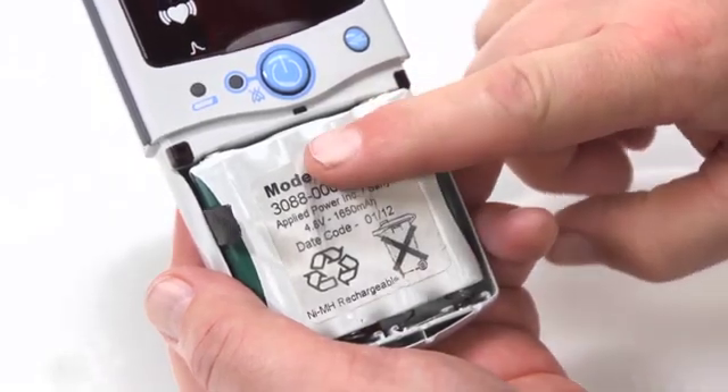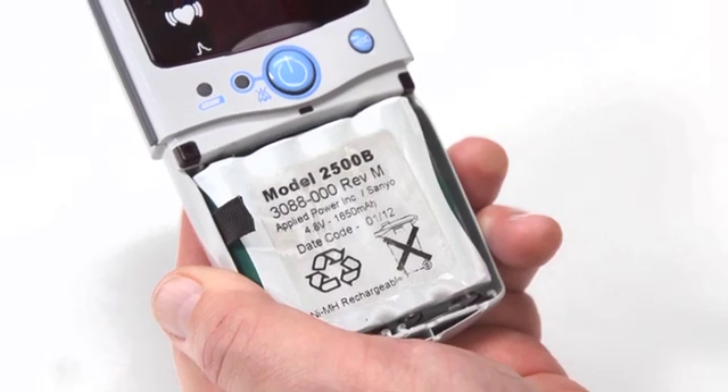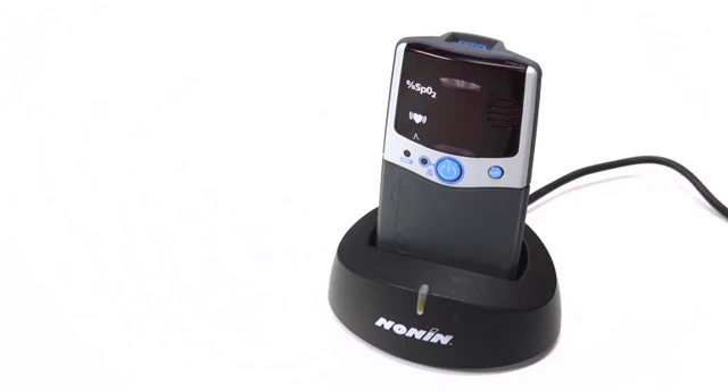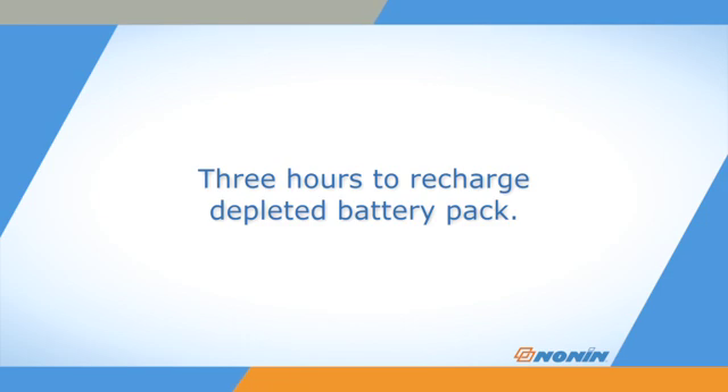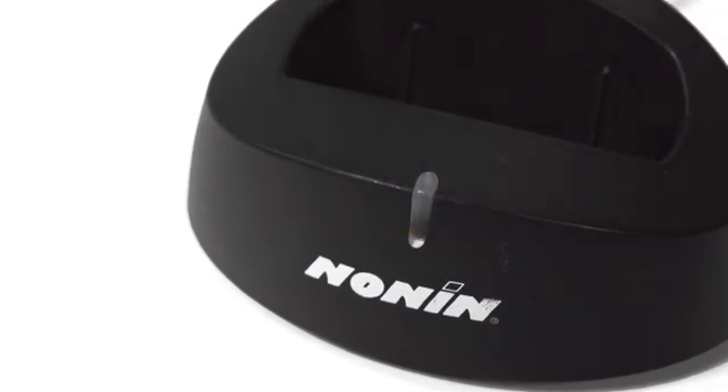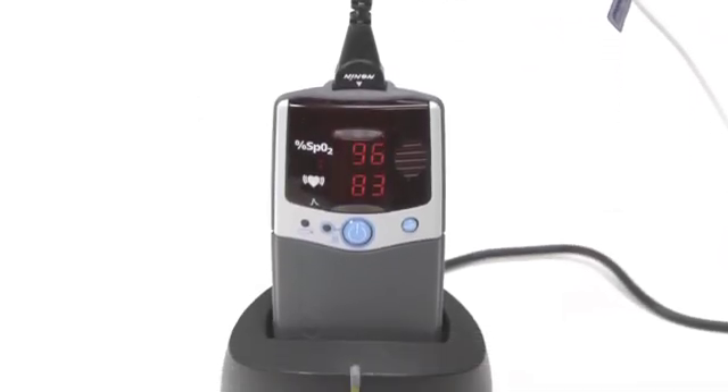A rechargeable battery pack may be in place in your Model 2500 oximeter. If so, you can recharge by placing the monitor in the Model 2500C recharger stand from Nonin Medical. Recharging takes about three hours when the battery pack has been completely depleted. The charger indicator will remain solid green while charging and flash when the battery pack is fully charged. You may leave the oximeter in the stand to maintain a full charge between uses, and you may also use the 2500 oximeter while it is charging.